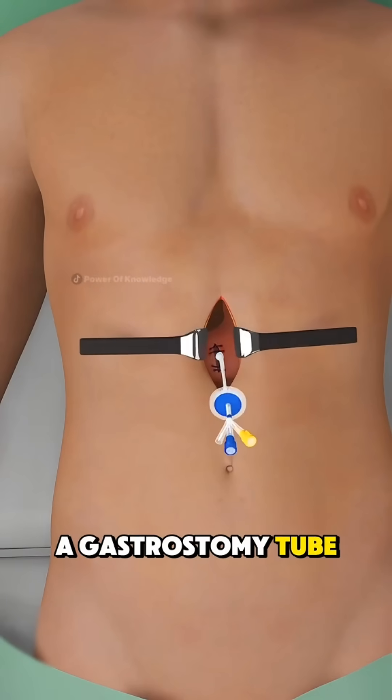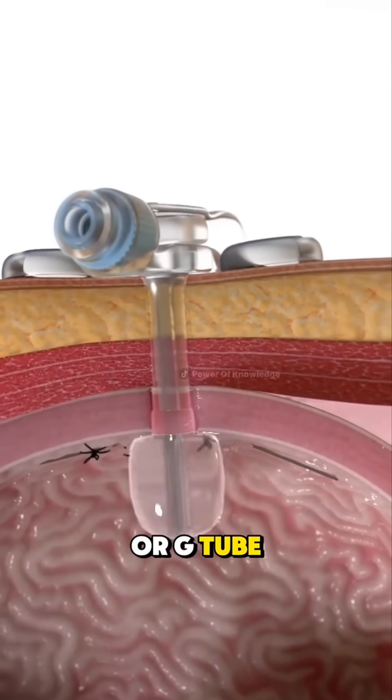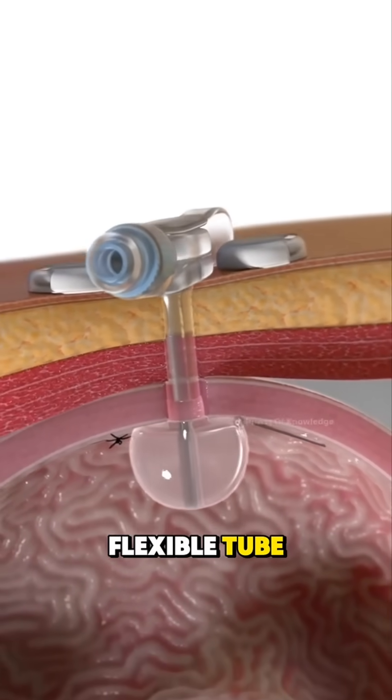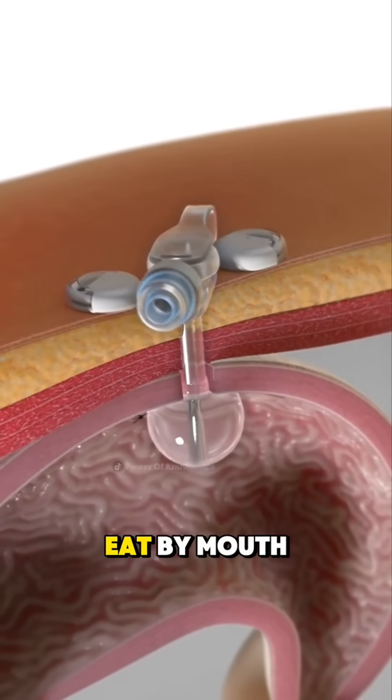Ever wondered how a gastrostomy tube is placed? A gastrostomy tube, or G-tube, is a soft, flexible tube placed directly into the stomach to provide nutrition when someone can't eat by mouth.